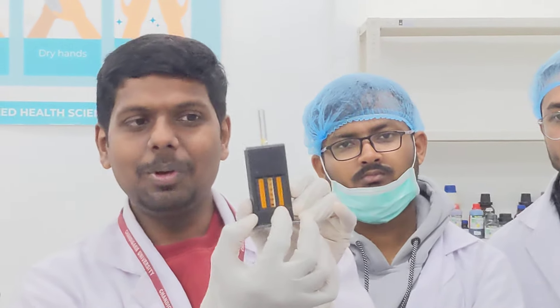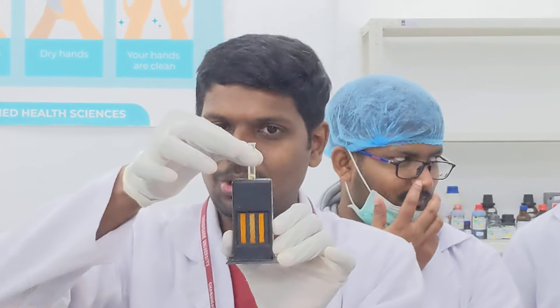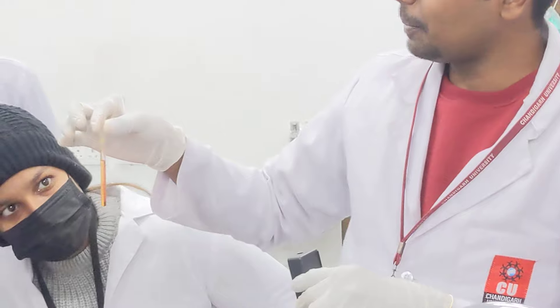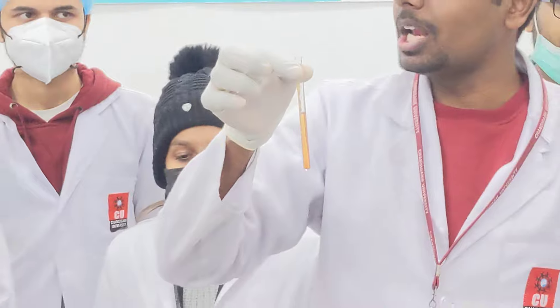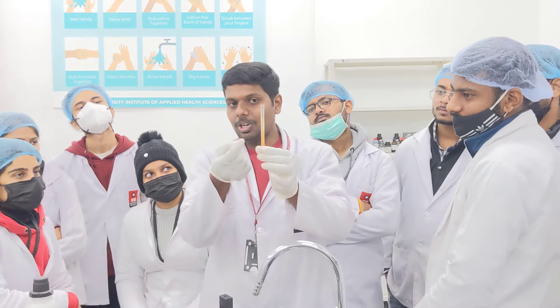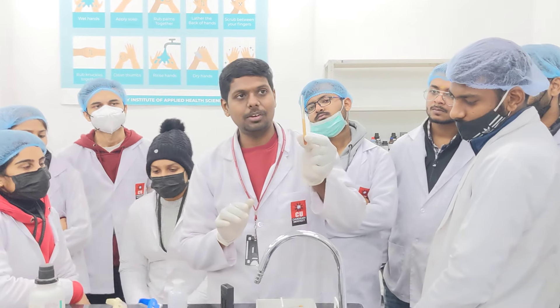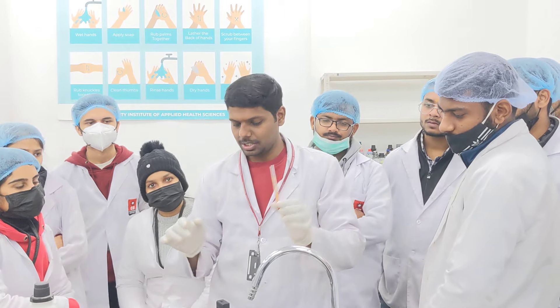Now the color of the test tube has matched with the comparator. After matching, remove the tube and read the upper meniscus reading. The upper reading is 16. The normal value of hemoglobin is 12 to 16, so this is in the normal range. If performed properly the value would be around 14, which is a proper average value. This is how we perform the HB test by Sahli's method.